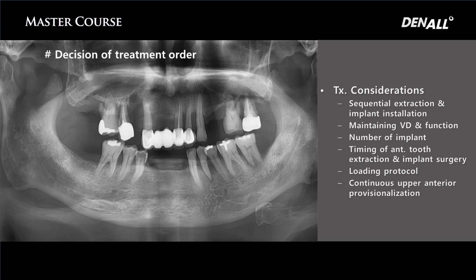You also need to think about the loading protocol. It's very complicated. We need to do it step by step, following patient's demands. In the case of number 13, immediate extraction was necessary, but I left this.